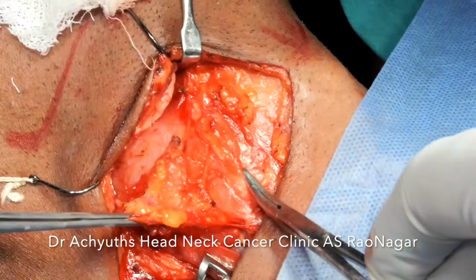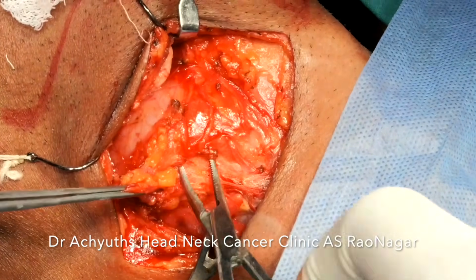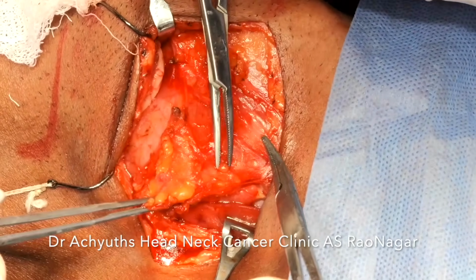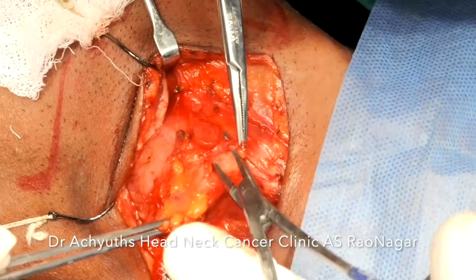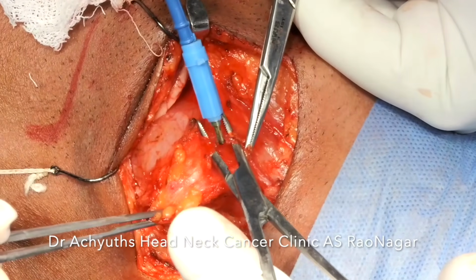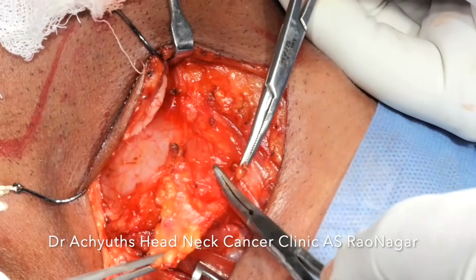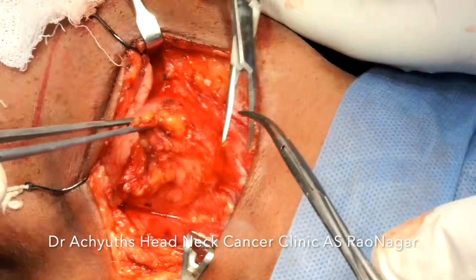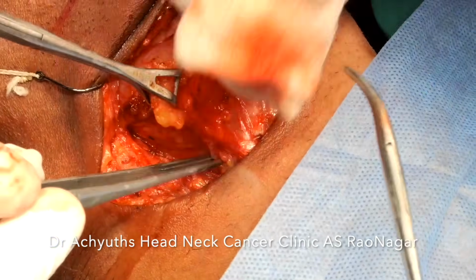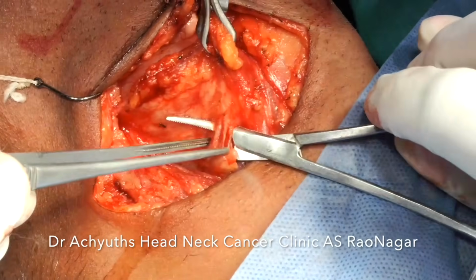So every time, with the help of digital palpation, we reorient ourselves with the structures which are attached. We don't want to divide any muscle attachment unnecessarily. Only if it is very densely adherent will we try to divide that muscle. Otherwise, if it is very much amenable to peeling off from the cyst wall without breaking the cyst wall, then we would try to preserve the muscle, because any extra amount of muscle that is being dissected and resected will lead to some amount of dysphagia in these patients, and laryngeal elevation is a little affected.